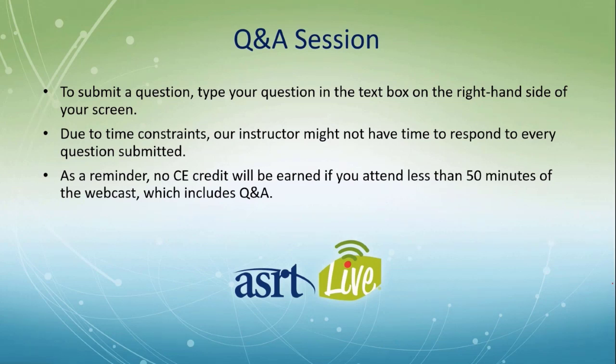What are your thoughts on virtual grid as an actual grid? Virtual grids are not quite as effective as real grids. And so one of the things we did in that presentation is talk about using them in some combination. And there is the possibility, not necessarily for eliminating grids altogether, but for reducing grid ratio. If we would use the virtual grid technology and use some of the other things that are discussed in that presentation, what we could possibly do, for example, is cut all our grid ratios in half, including all of the grids that are in our bucky trays in their tables. We could be using perhaps 8-to-1 grids or 6-to-1 grids instead of 10 or 12-to-1 grids, and that saves patient dose again.